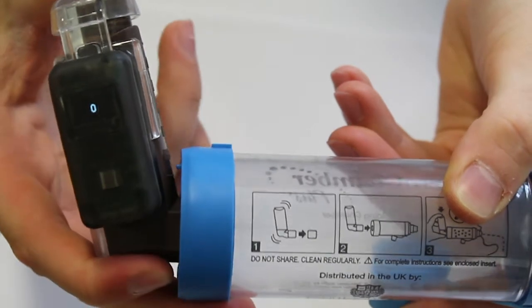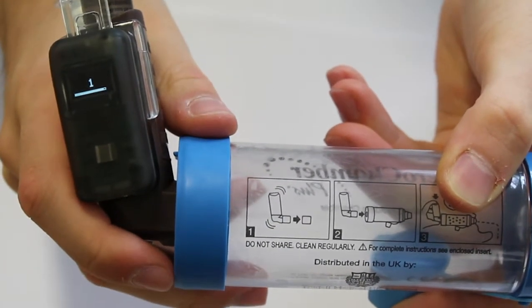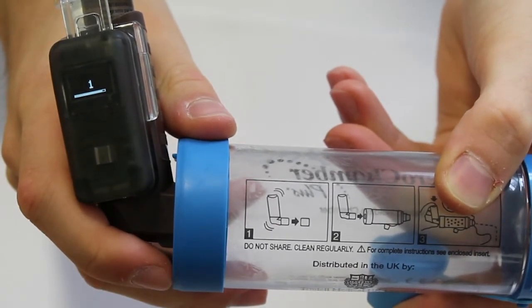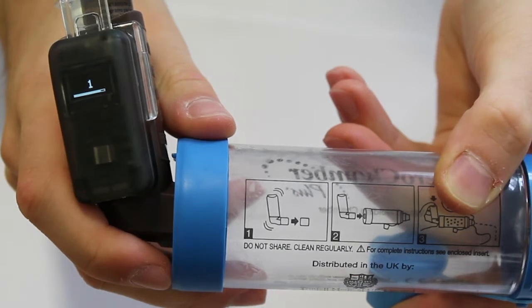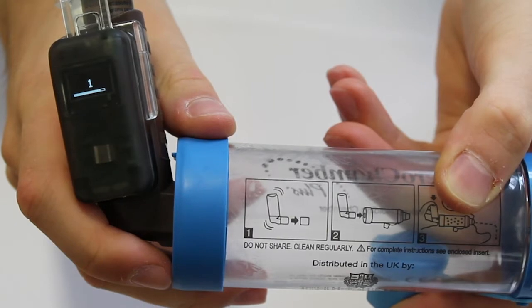Puff clicker will buzz and display an increased count once you've taken a dose. A progress bar will empty over the course of 30 seconds. Wait until the bar is empty before shaking the inhaler and taking another dose.